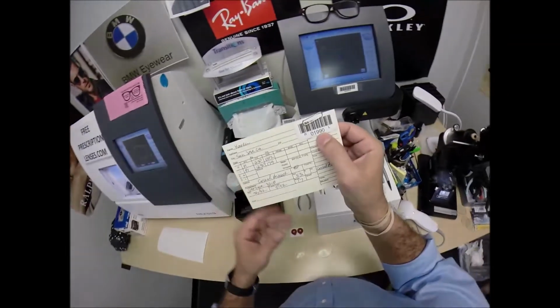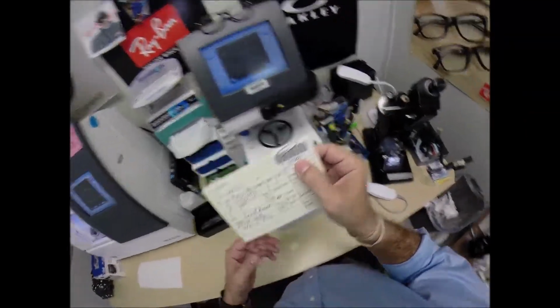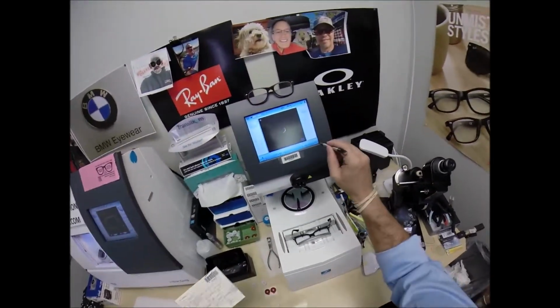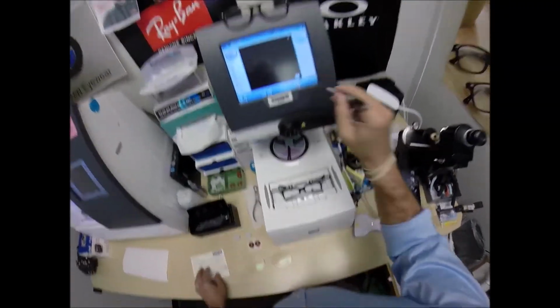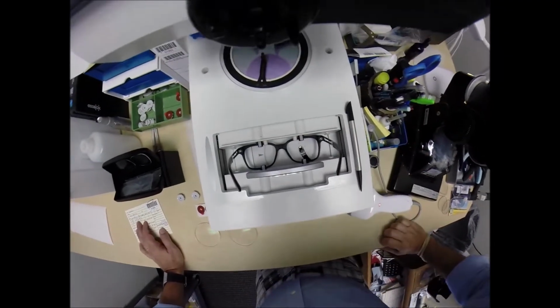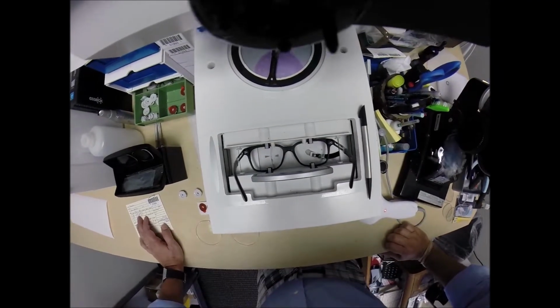I'm going to program this shape into the computer. You are Secret Agent 1990. Let's go ahead and do that. We're going to hit the start button. A little stylus is going to pop up, go around and trace the inside bevel of the right side of the frame before doing the same thing on the left.